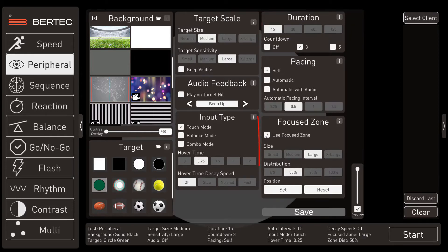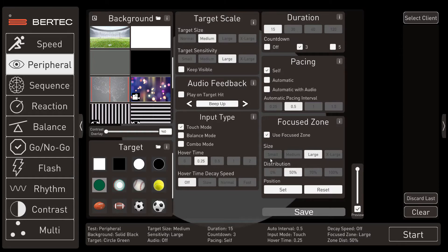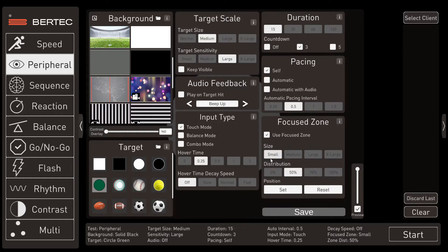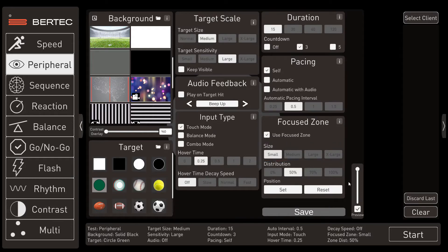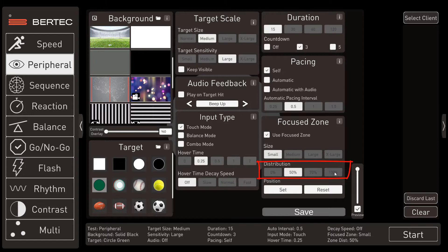And here is when we first start to use the unique focus zone box. We're going to set this focus zone size to small, and that will keep the targets all within the central 30 degrees. And next we'll set the distribution to 100%, which will put all the targets within that focus zone.